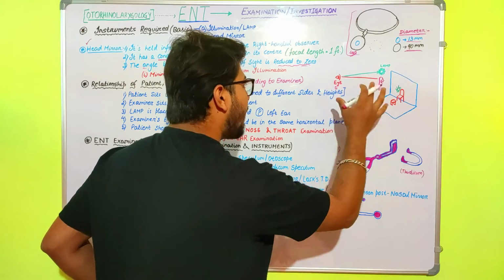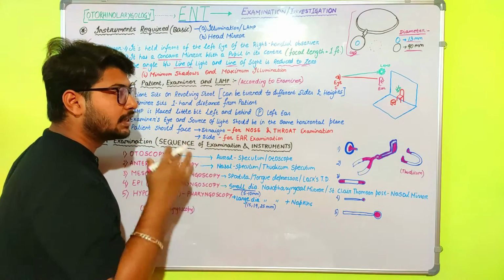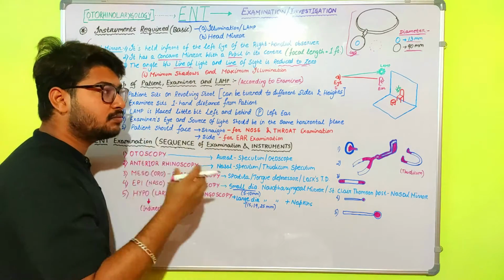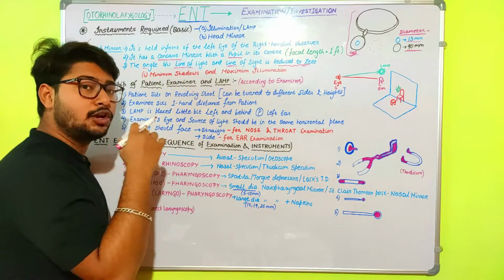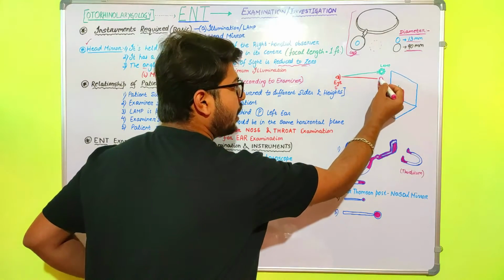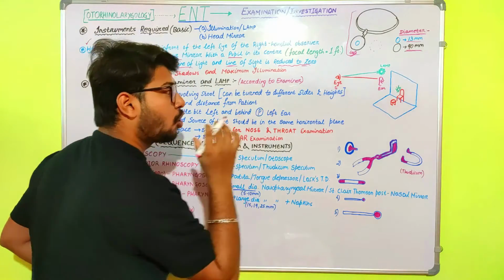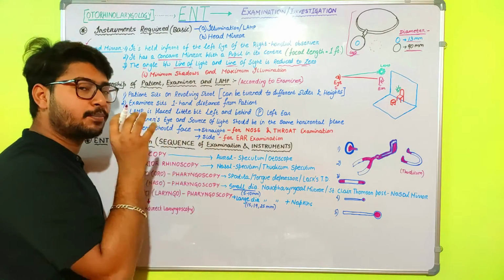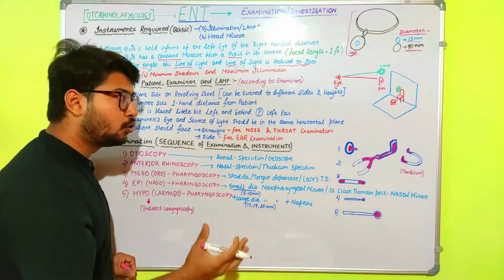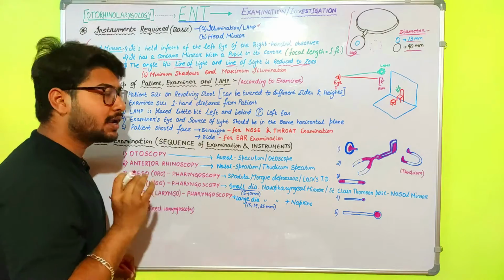Okay, so what happens if the angle between the line of light and the line of sight is not zero? Then the examiner who is observing the ENT organs will not see things clearly, because the lamp will reflect and the light from the observer will come to the eye. If the angle is not reduced to zero, then we cannot have proper vision. That is the requirement: there should be proper illumination in the whole room, so that we can identify each disturbance in the ENT organs.